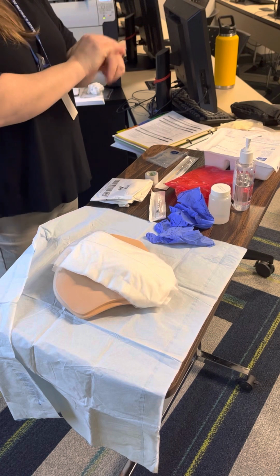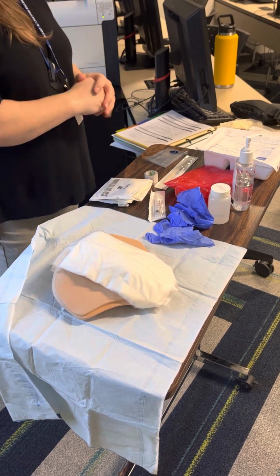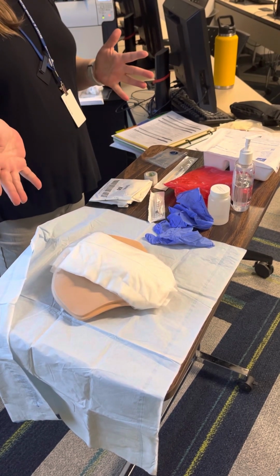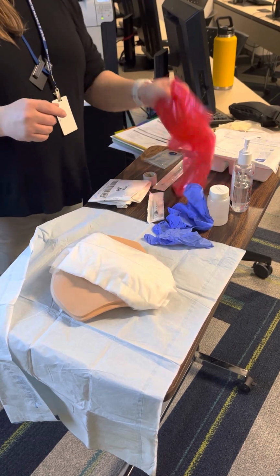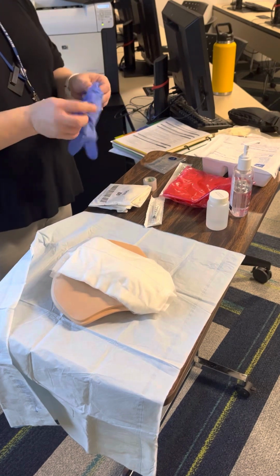I'm going to prepare my equipment on the side that I'm going to do this so everything looks set out nicely. I am going to make sure that the patient is draped adequately on the side that I need to do this. I am going to place the garbage bag within reach. It's right here. I am then going to apply my clean gloves.